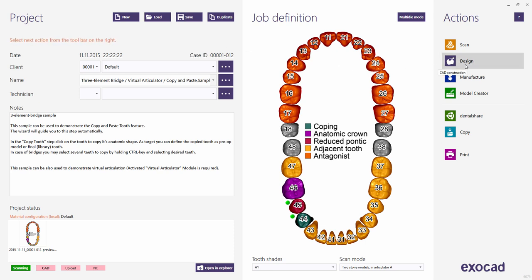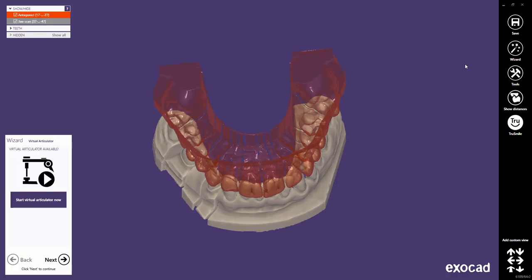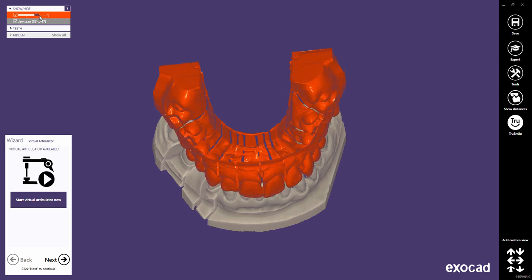Now click the Design button to proceed to the design. In the DentalDB, we defined the scan mode for two stone models in Articulator A. Thus, the wizard will start automatically with the Virtual Articulator, if this add-on module is activated on your dongle. To have a better visualization of the Virtual Articulator's effects, I prefer changing the Antagonist transparency in the Show-Hide window now. You will find more information about the Show-Hide window in a separate tutorial.